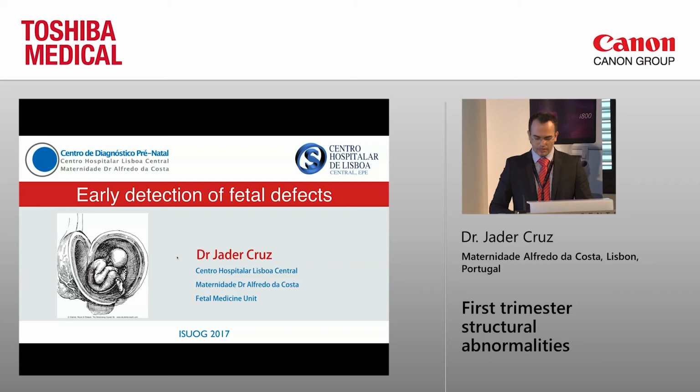Going to talk a little bit on early detection of fetal defects, which is another way to say structural abnormalities in the first trimester. And then we will move to a live scan. I think that's the sequence.